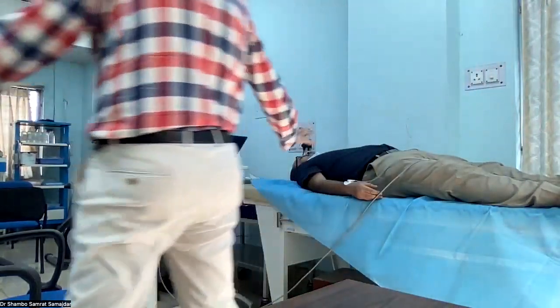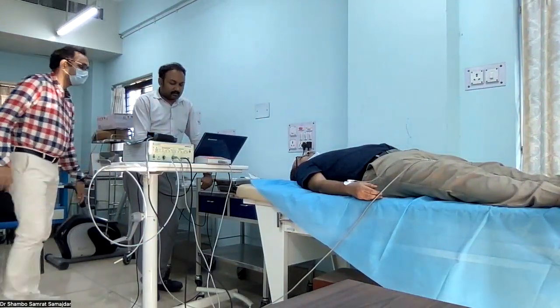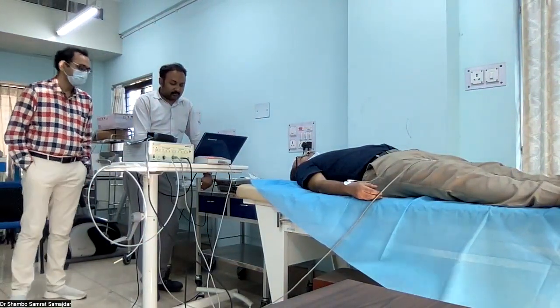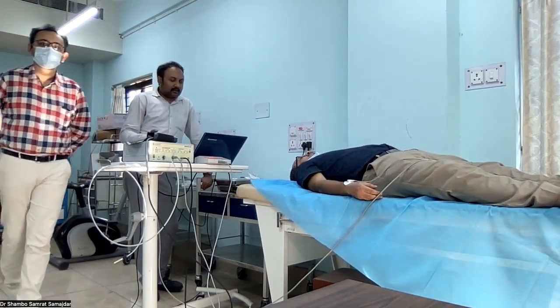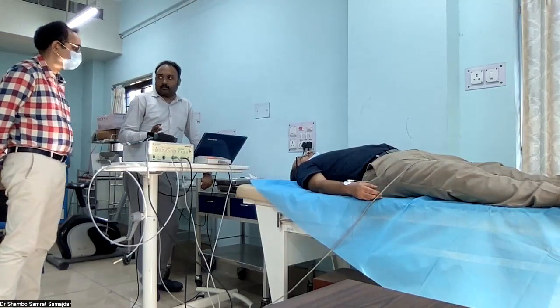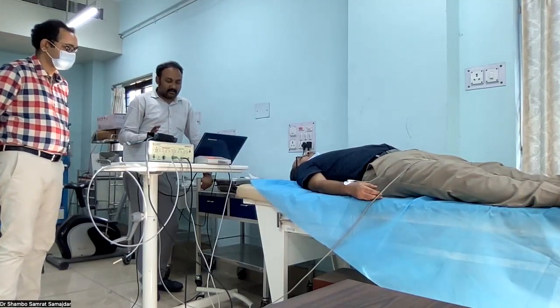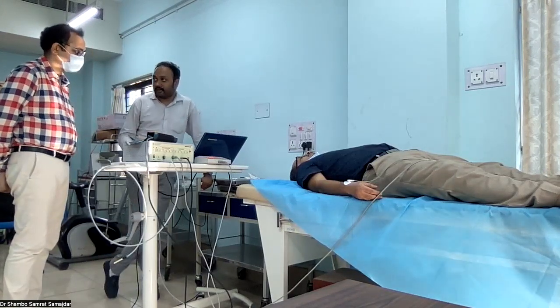So you have to be in rest position, isn't it? Now, we will ask the patient to be in supine position and should be relaxed and should not make any kind of body movements for 5 minutes. And the machine will record ECG for 5 minutes and will check for heart rate variability.